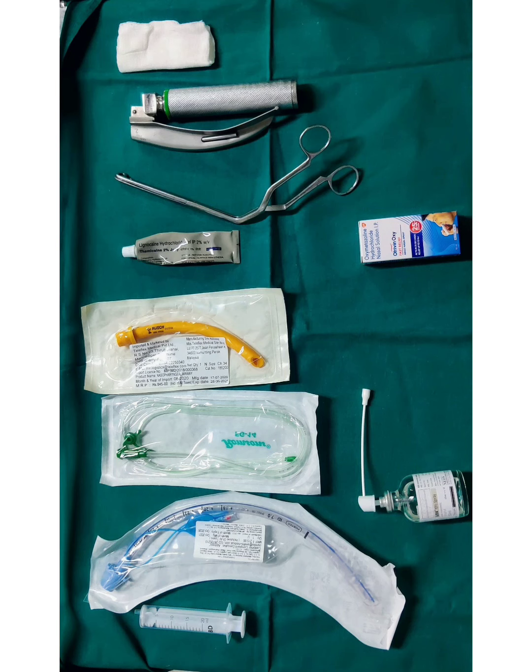Apart from routine preparation of the airway trolley for intubation, we also need Otrivin drops, that is, oxymetazoline hydrochloride nasal drops, which is a vasoconstrictor and reduces the associated mucosal bleeding. Lignocaine jelly lubricates the nasal passage to allow smooth passage of the endotracheal tube, and also lubricates the endotracheal tube, especially the cuff.